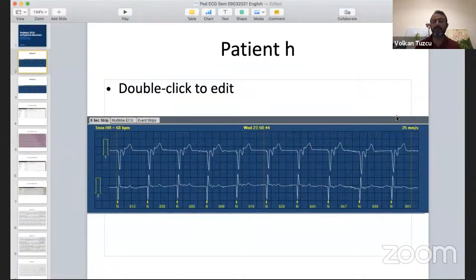The other thing is, could it still be junctional rhythm with a wide QRS? Is it possible? Let's say this is a 10-year-old and the QRS is much wider. No question that it's really a wide QRS, and it's like this, with P waves after the QRS. Could it still be junctional rhythm? Any answers, please? It could be. How could it be?